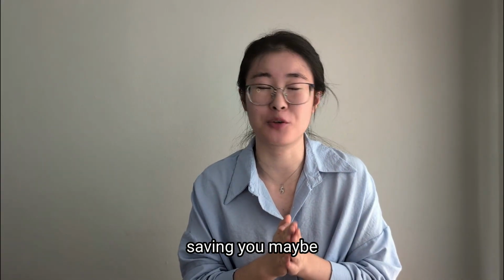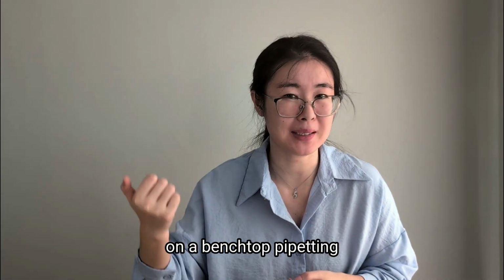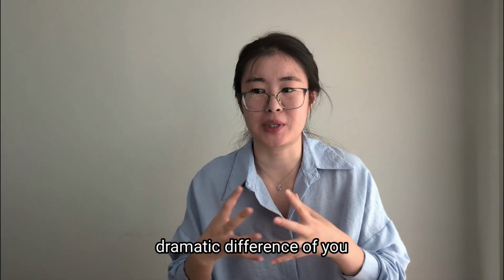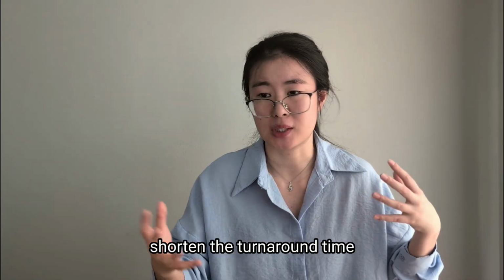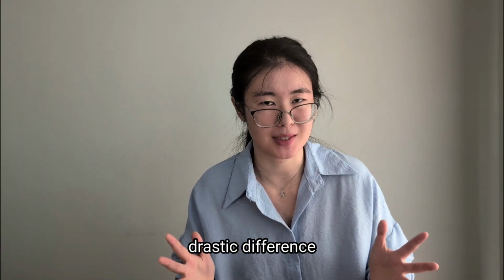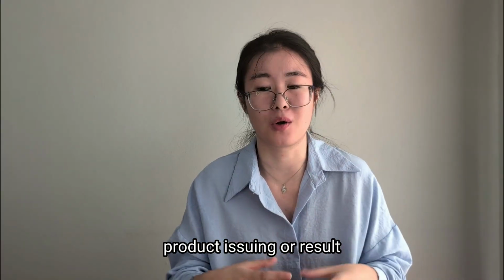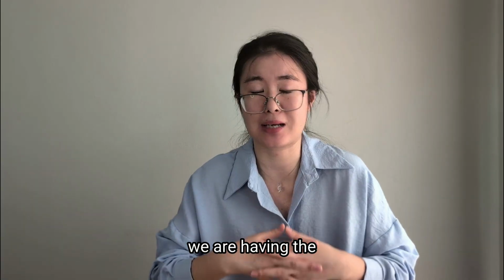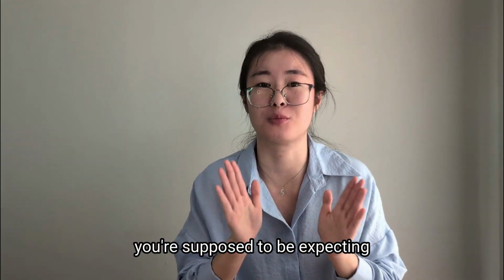But that is only saving you maybe up to 3-4 minutes on benchtop pipetting. It is not something that would make such a dramatic difference in you getting the blood product or a cross-matching antibody screening result, shortening the turnaround time from 1 hour to 10 minutes. That is not that drastic a difference. So don't expect lightning speed of product issuing or result crossing over if your hospital later on announces, oh, we are having the electronic cross-match system now. That's not what it is for, and that's not what you're supposed to be expecting.